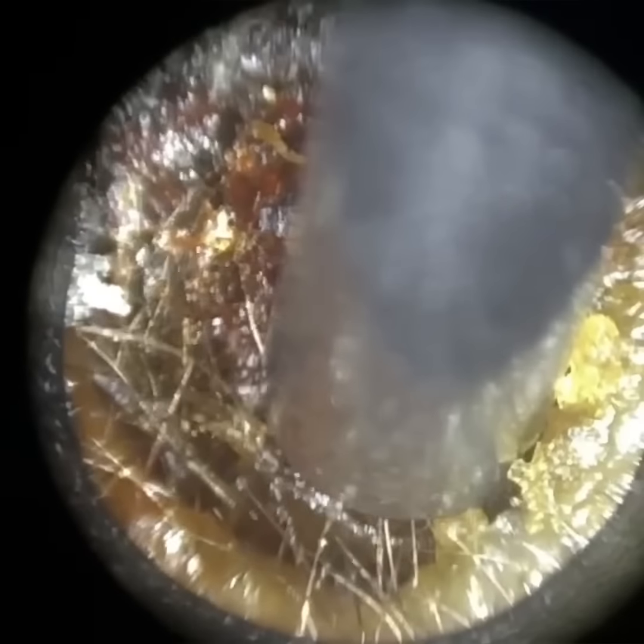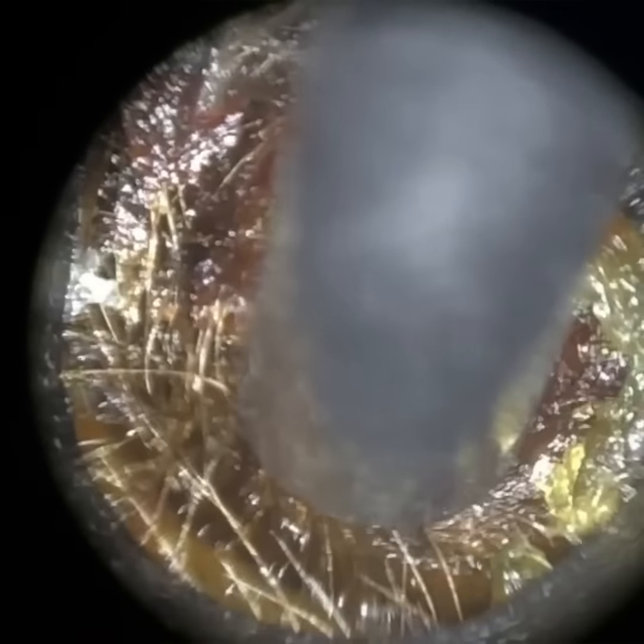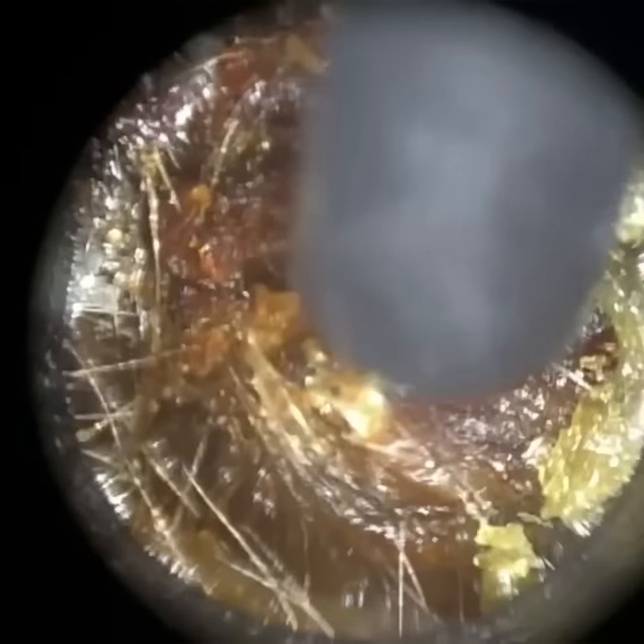Thank you for joining me in my latest video using the WAXscope, and here we had a really complex case of a patient who attended with a severely occluded and impacted wax buildup in their left ear. I'm using our medium-sized speculum, which is a 4.25mm speculum. This is the most common one that I use. And if someone's got narrower ears, I will sometimes revert to our smaller pediatric size speculum, which is 3.5mm. And we've got two larger ones, a 5mm and a 5.75.